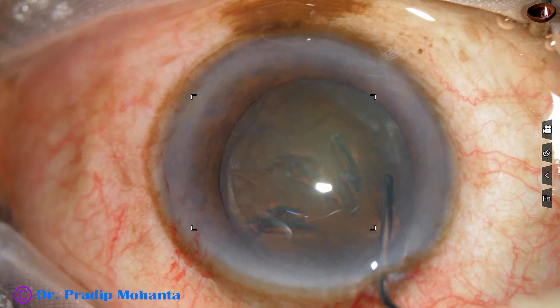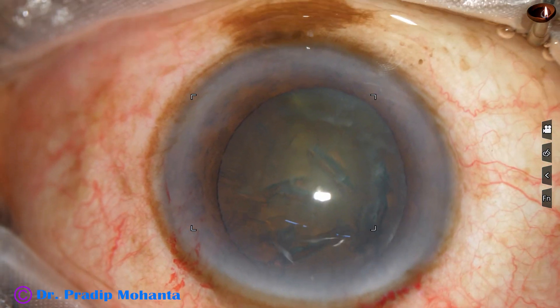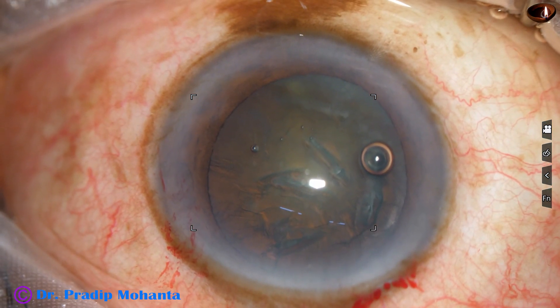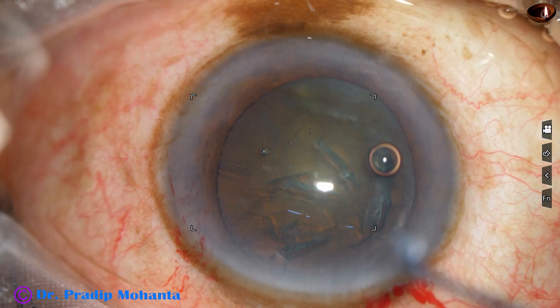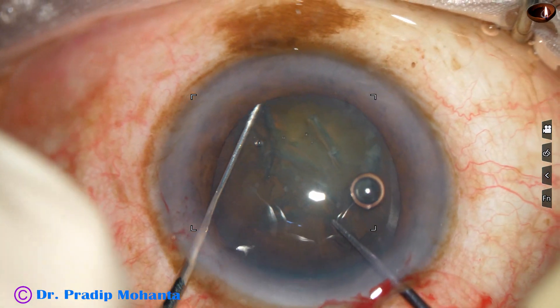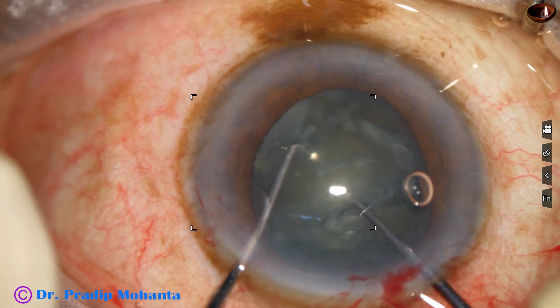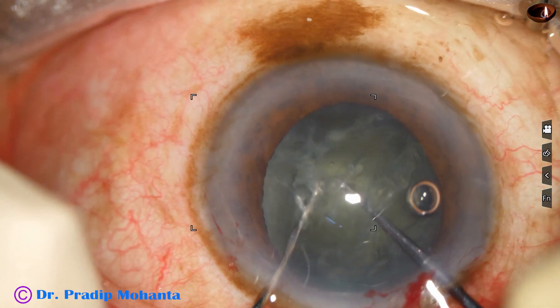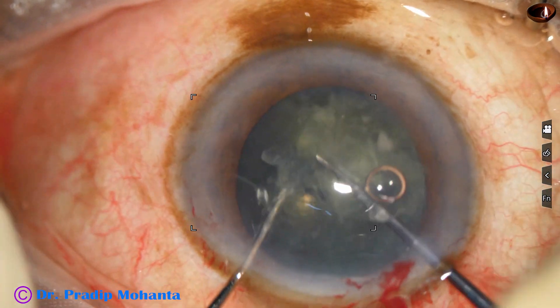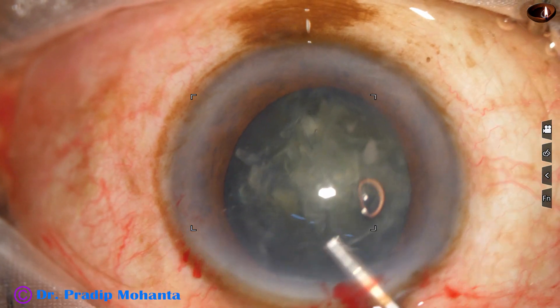The nucleus is tapped and rotated a little bit. Since the cataract appears on the softer side, I am going to use a pre-chopper designed by Dr. Sohail Irfan Khan. Within a few seconds, we divide the nucleus into two hemi-nuclei, rotate it and divide one hemi-nucleus into two pieces, then rotate and divide the other hemi-nucleus into two pieces as well. So within about 15 seconds, we get four pieces.